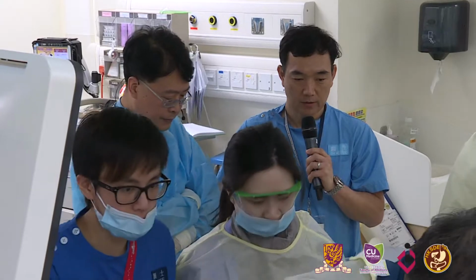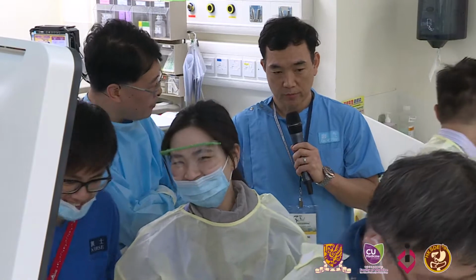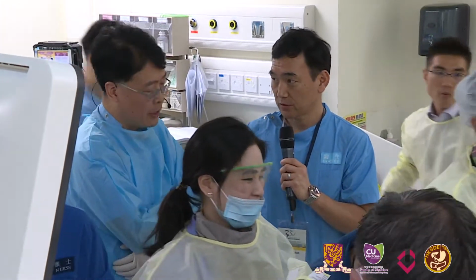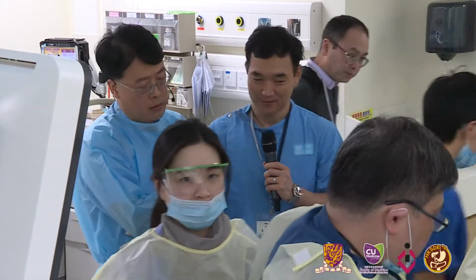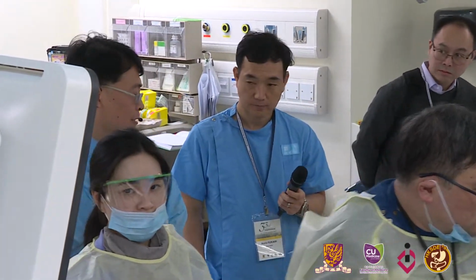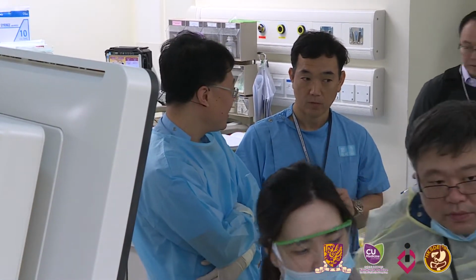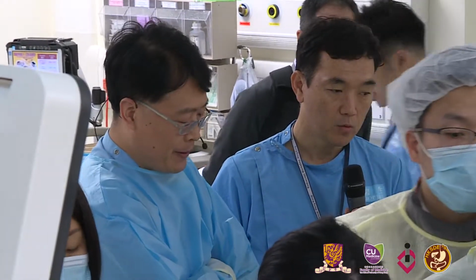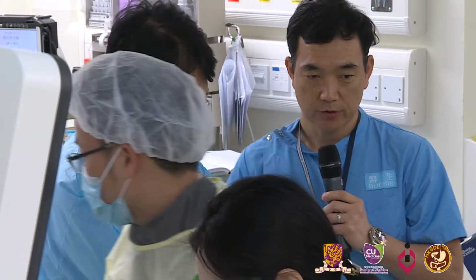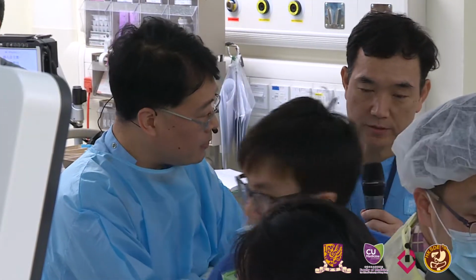But as you mentioned, the surgery on the posterior wall can be a little more challenging. If you can take it out, that's great for the patient. And before resecting the lesion, do you think pathology is necessary, by EUS FNA or some other methods to take a biopsy? It would be comforting for the patient, who is risking possible complications, or just accepting the risk.